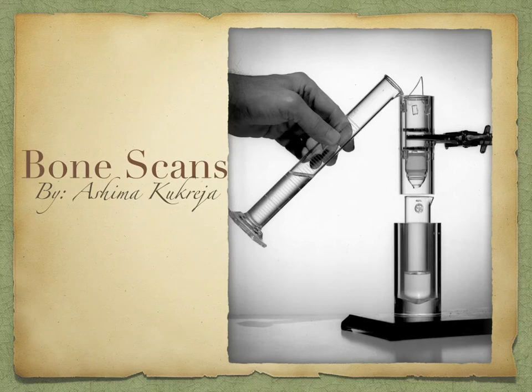A bone scan is a test which provides a picture. It uses a small amount of radioactive substance called tracer, which locates or monitors cancer that begins within the bones or cancer that has spread to the bones as it started from another part of the body.